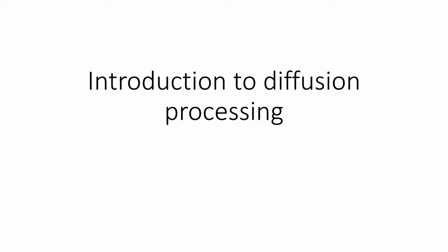Now I'm going to give you an overview of very basic diffusion processing, and then we'll have a different video that will walk through the steps on HiPerGator. These instructions are using different data than we'll be using for the assignment and for the walkthrough on HiPerGator, but the methods will be very similar. It's just when we do it on HiPerGator, we'll need to write a little script to do it. But these instructions are from a local installation of FSL on a Mac.